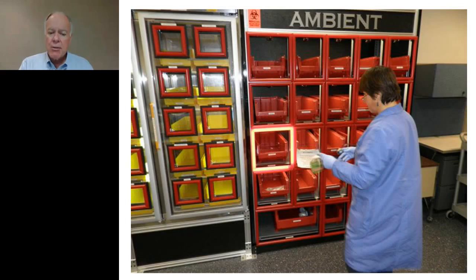So this is the sort-to-light system, which maybe reminds you a little bit of Hollywood Squares. The employee has one of these manual specimens that can't go on the track in their hand. They read the barcode, and this little lighted square lights up, and that's the bin that they place that specimen in. It has eliminated a lot of missorted specimens because previously they had to read the label to find the department or lab section where that specimen was supposed to go. And so a lot of specimens were getting missorted and misdelivered, and then we had to trust that people would bring them back or whatever.